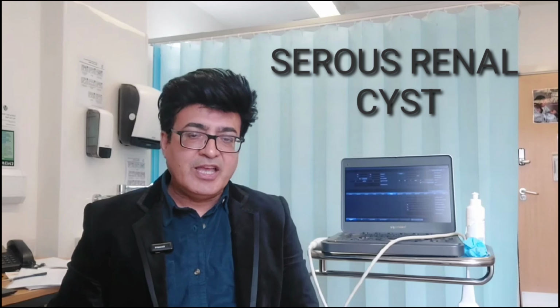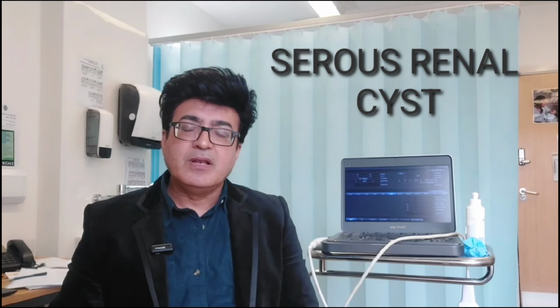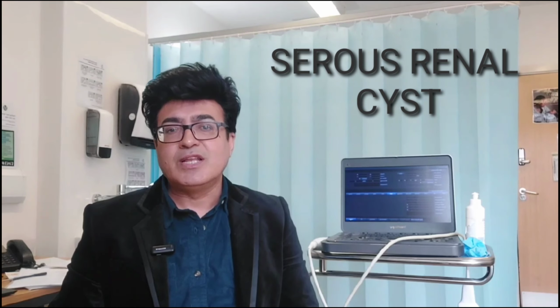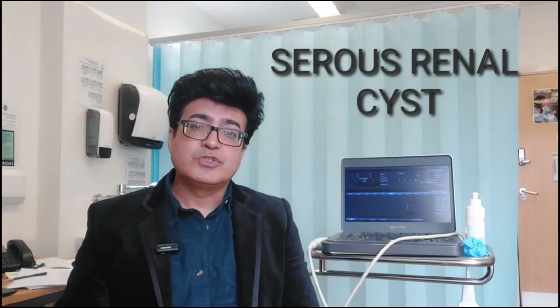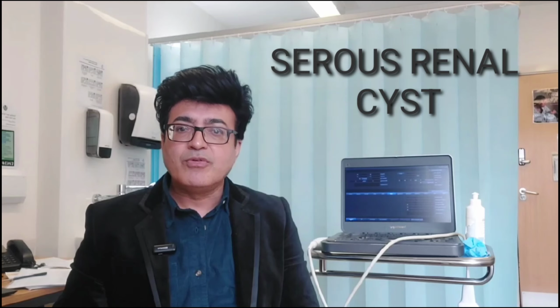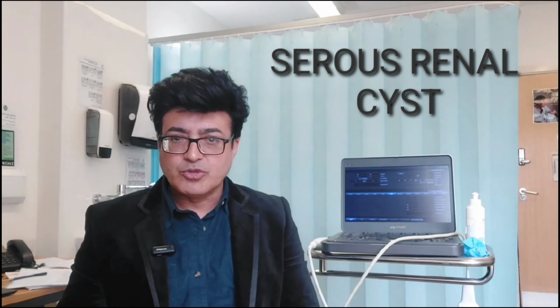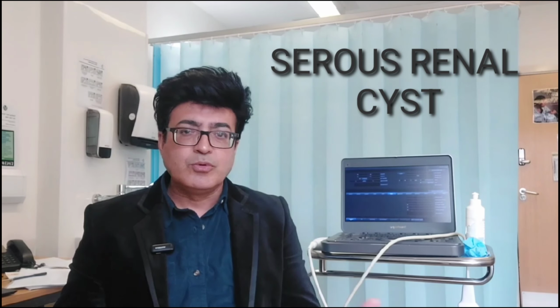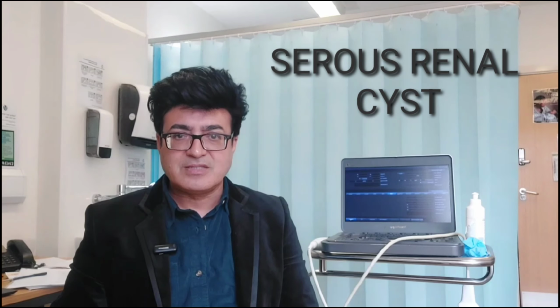Today, the topic which I have selected is a very common one, that is simple renal serous cyst. Every now and then you will come across cysts on the kidneys, and you might be confused how to label that case. So this is usually a common renal serous cyst. It happens to be small, it happens to be large, it happens to be single, it happens to be multiple. So many varieties you will come across with these serous cysts.